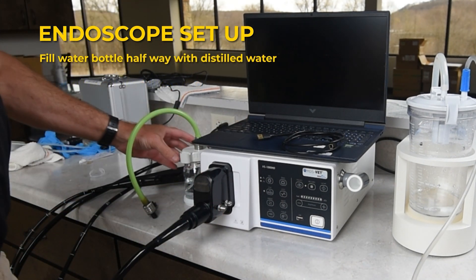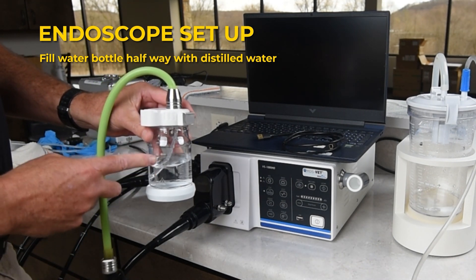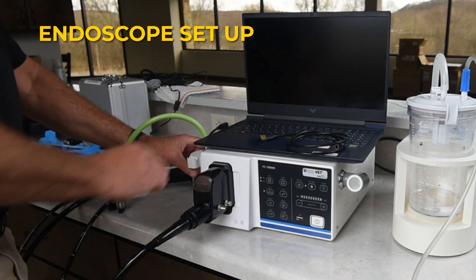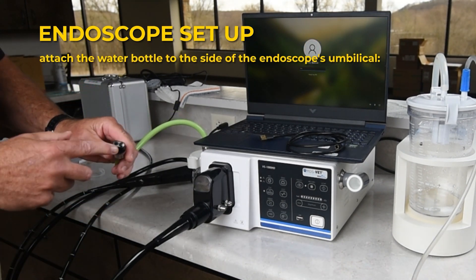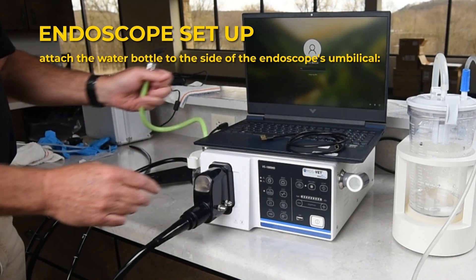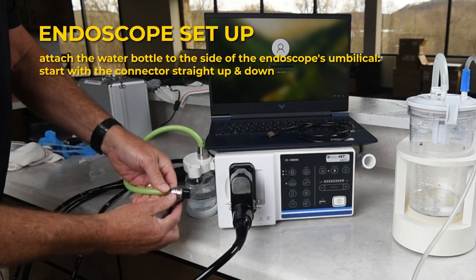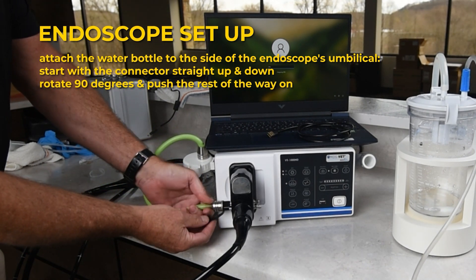Fill the water bottle halfway between the two indicator lines with distilled water — no tap water — hanging it on the side of the unit. Attach the water bottle to the side of the endoscope's umbilical, ensuring a secure fit. Start with the connector straight up and down, rotating 90 degrees as it's pushed the rest of the way on.